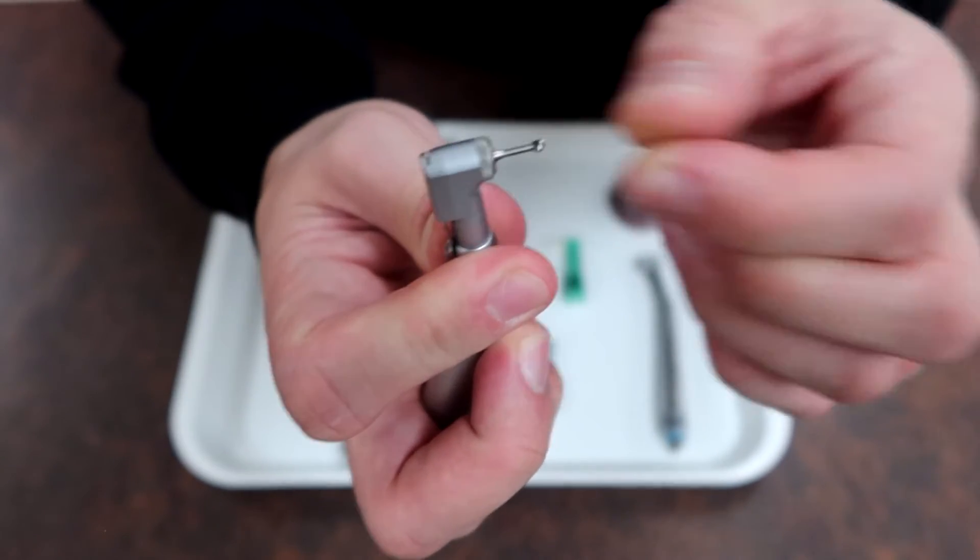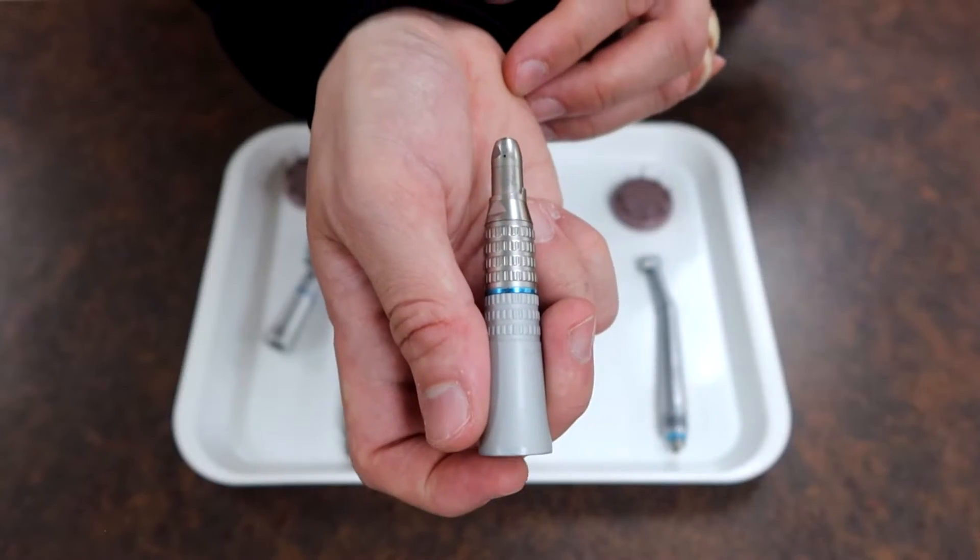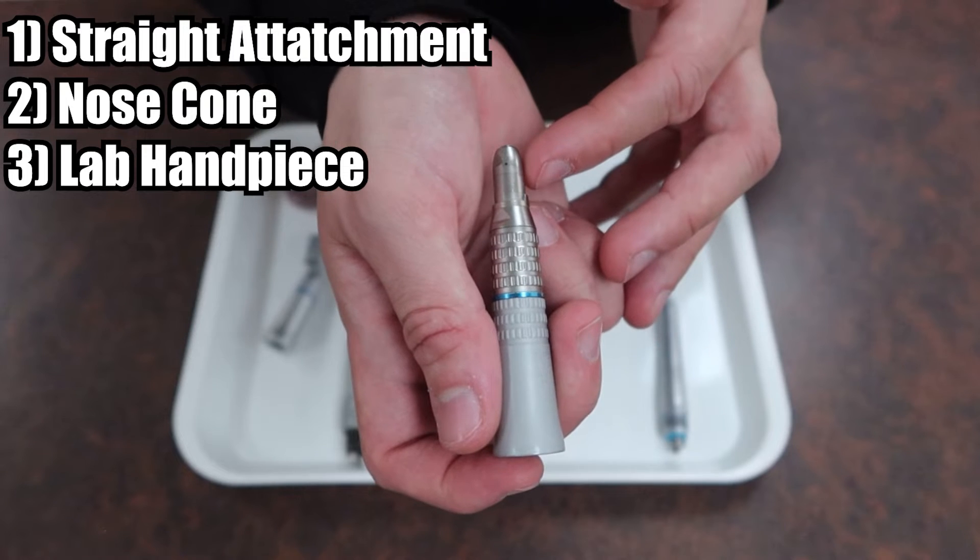Once the bur drops into place, take your latch and lock it down, making it so you can't pull the bur out without unlatching it first.